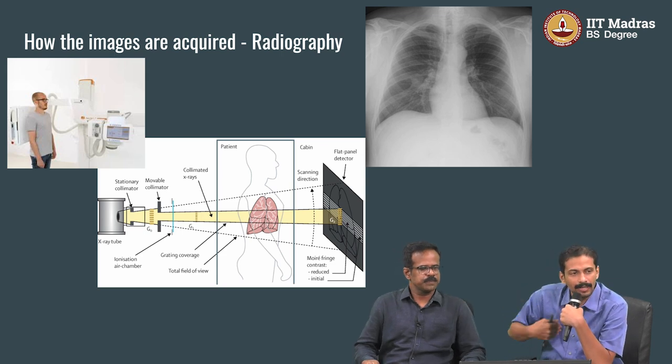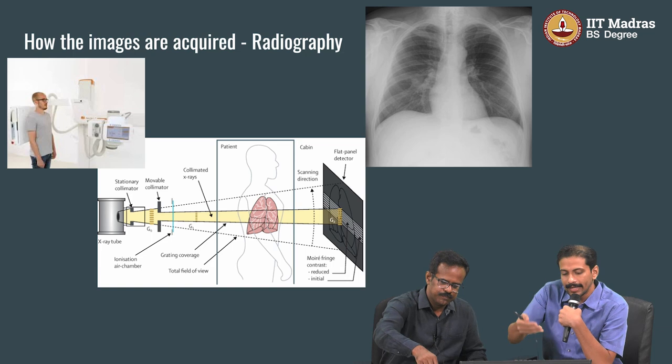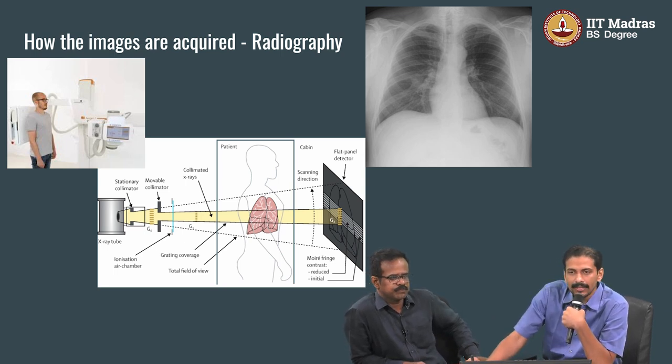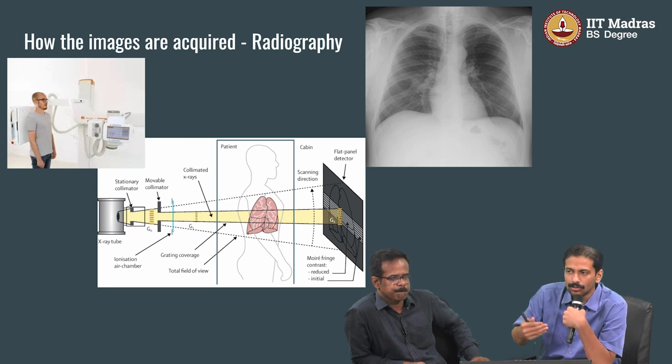The photons enter and exit the body. We collect the data through and through. When the photon crosses the body, it gets refracted, absorbed, attenuated; all kinds of interactions happen within the body. Anything which crosses the body will have to undergo all these interactions. After those interactions, it comes out of the body, and that is where you capture the X-ray photons. Once you capture that, it gives an idea of what is happening within the body, and that is how we image.